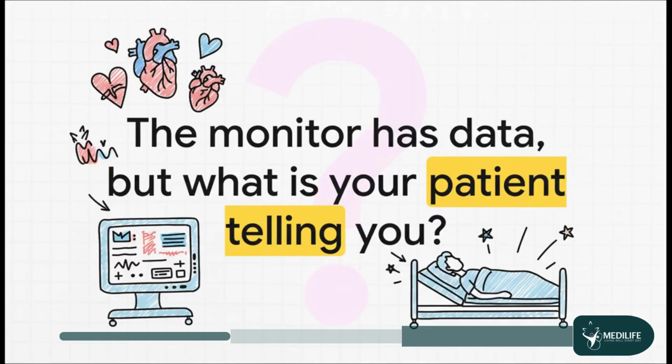Which brings us right back to where we started. We have all of this incredible data. Preload from our CVP and SVV. Afterload from SVR, the heart's pumping action from cardiac output. The monitor gives us the numbers, it gives us the clues, it gives us the trends. But at the end of the day, you have to put all of that together with what you see at the bedside. The technology is amazing, but the real question, the one you always have to ask is, what is your patient telling you?